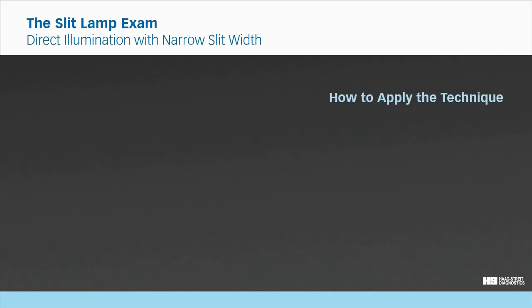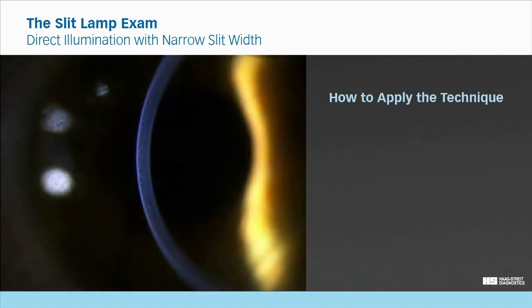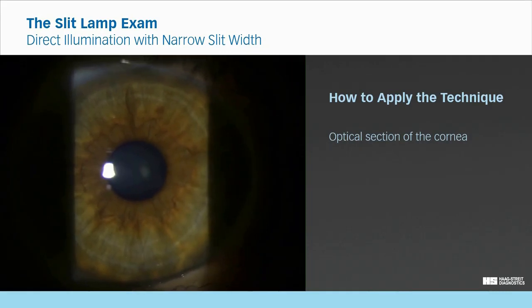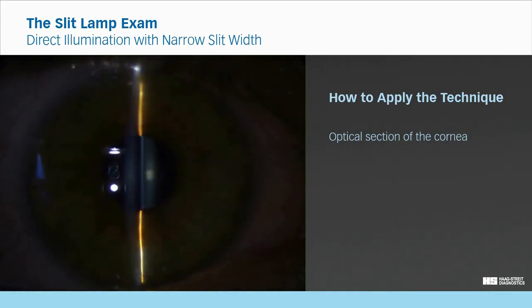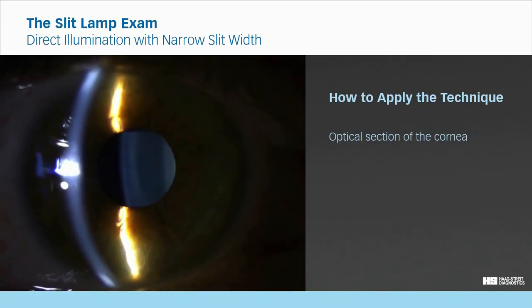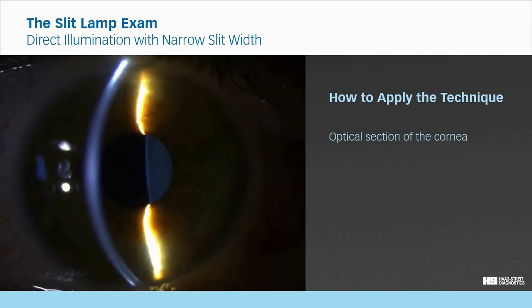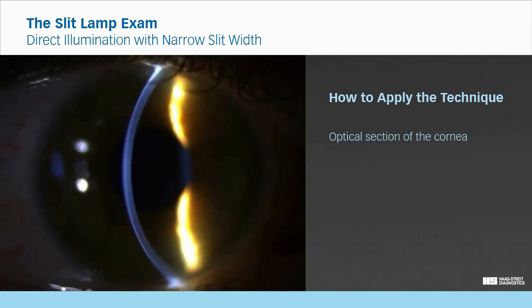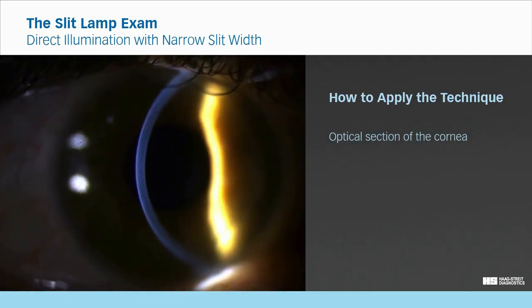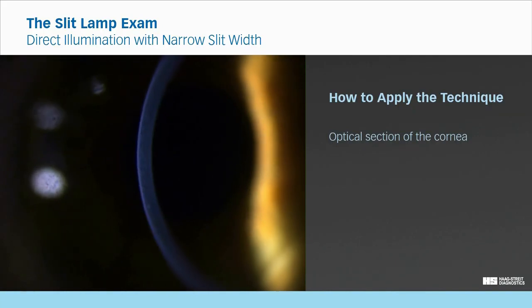How to apply the technique. It can be difficult to focus on a semi-transparent structure such as the cornea. A simple way of getting the cornea into focus is as follows. Move your slit lamp towards the patient until the iris is in focus. Narrow the slit and increase the illumination intensity. Then increase the illumination angle and move backwards. You can see the focus on the cornea moving towards the center the more you move the slit lamp backwards. Increase the magnification if required.